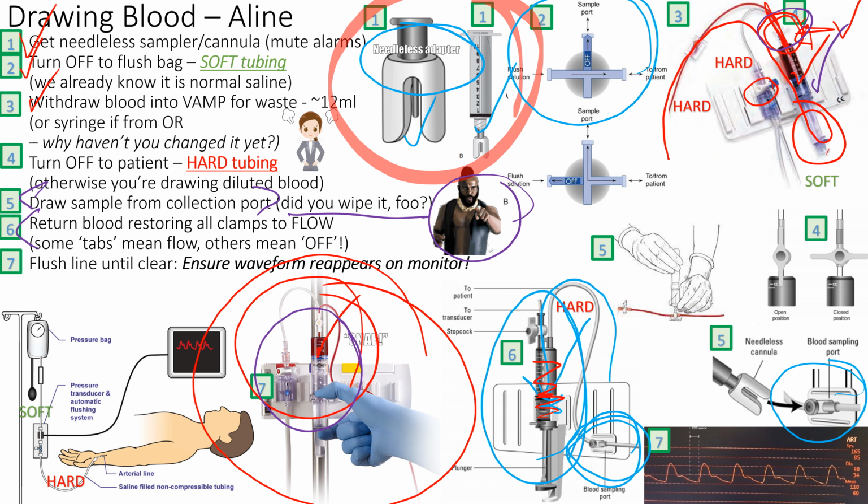You can see it going in, going in, going in, and then you give it another extra 2 seconds of flush, right? How do you flush it? You can use the syringe, but we have again that little pigtail right there that we pull, and that will push the fluid in, right? Because what's behind the pigtail is 300 millimeters of mercury. That's going to be flushed in, right?